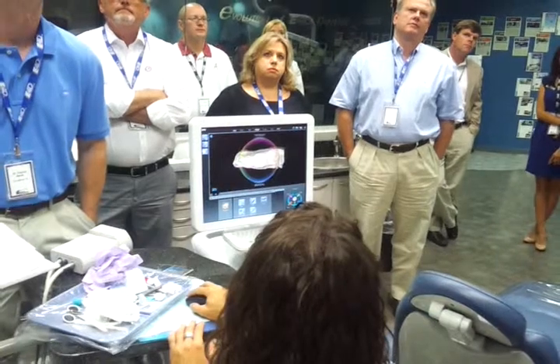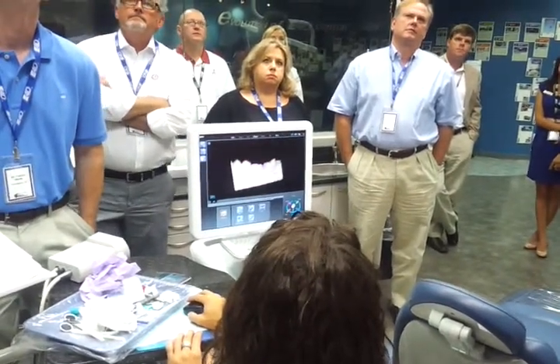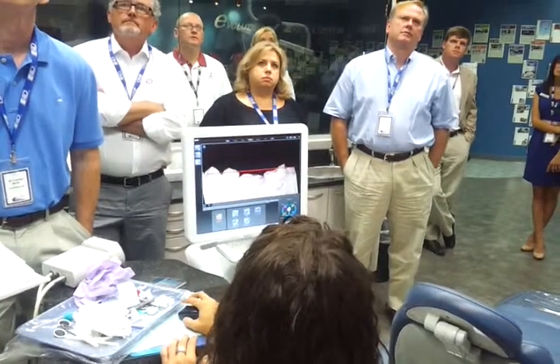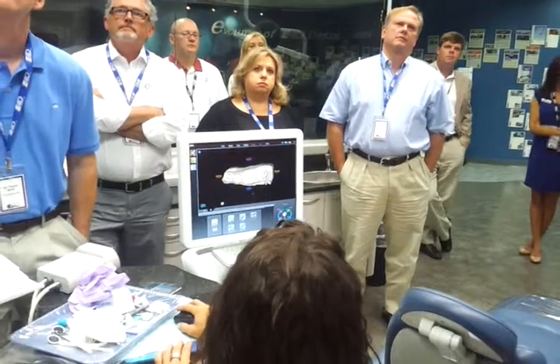I'm getting closer, a little bit more. There we go. So now what I'm just looking at right here are my marginal ridges. So my orientation is now set. Do the same thing on tooth number 18.